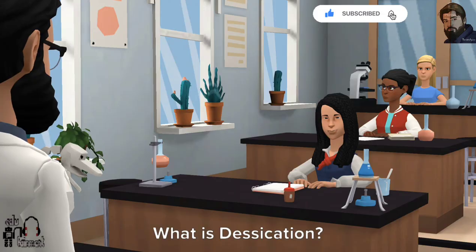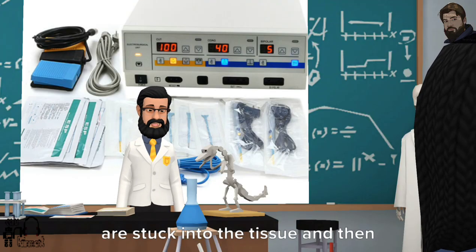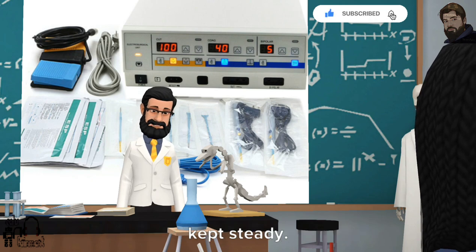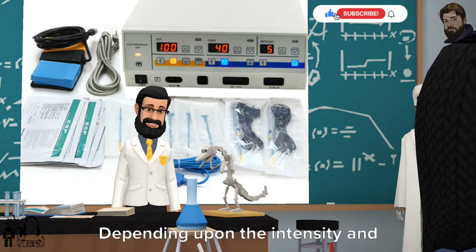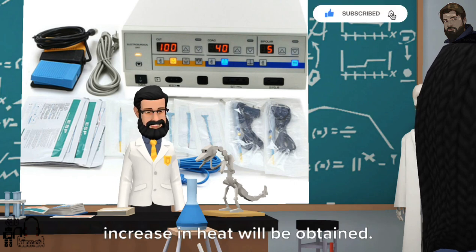What is desiccation? In desiccation, needlepoint electrodes are stuck into the tissue and then kept steady. Depending upon the intensity and duration of the current, a high local increase in heat will be obtained. The tissue changes due to drying and limited coagulation.